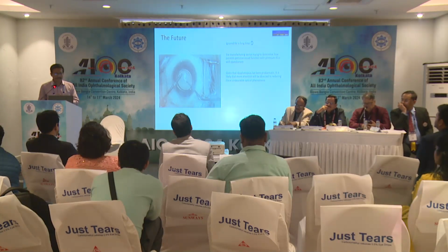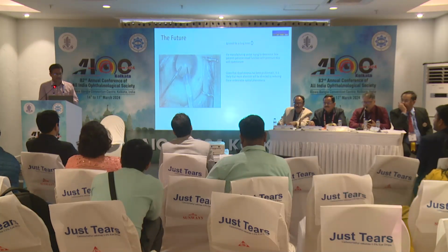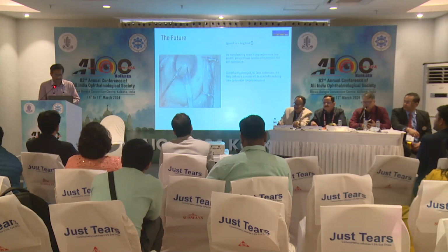So we must give it a thought. It is time for us to give it a thought for all types of IOL. So this may predict us to design the IOL optics and haptics in a new way, whereby we can place the haptics in the sulcus and bring the plane of the optic a little bit in front.